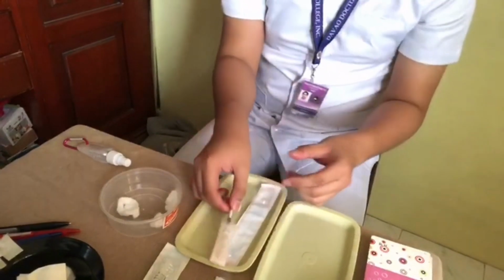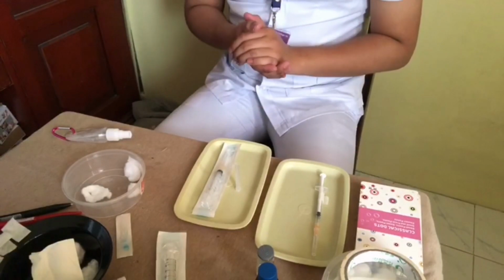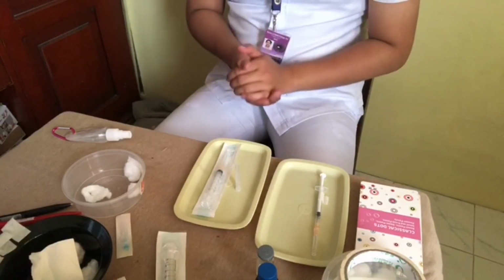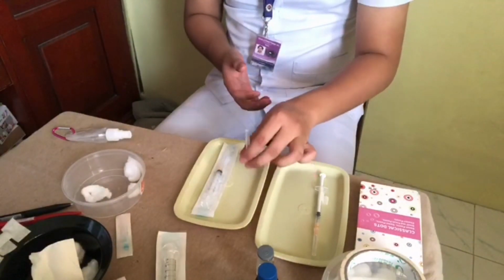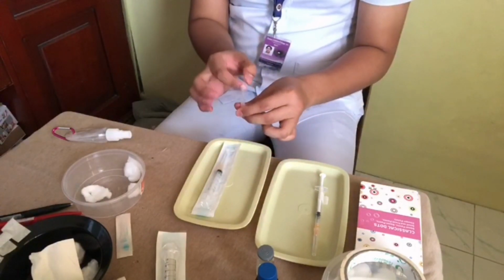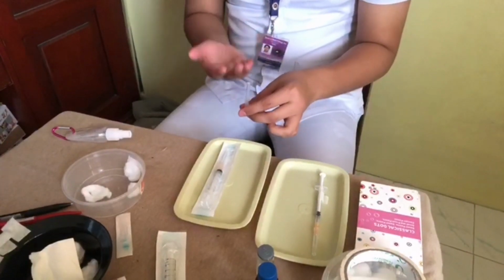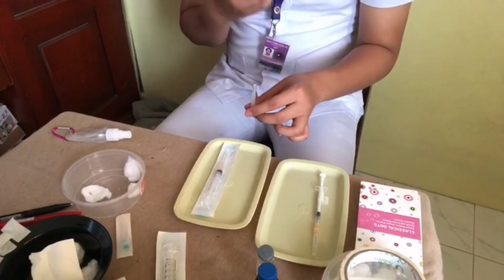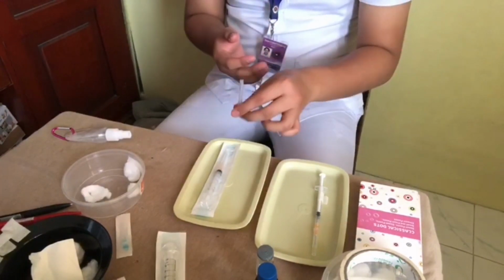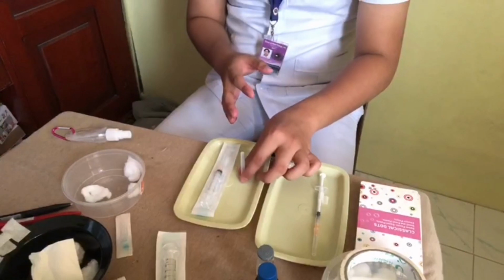Okay, we are done. Now we'll start the ampule preparation by flicking the upper stem of the ampule several times using our fingernails. Flicking this will bring all medication down to the main portion of the ampule. After that, we'll put the ampule on a flat surface.